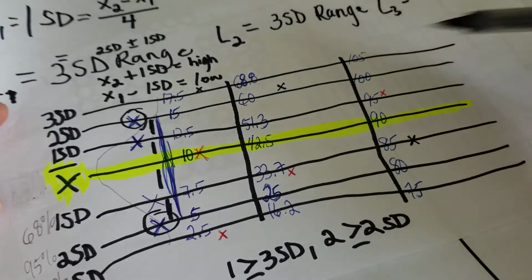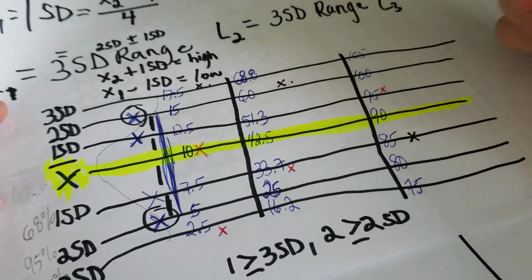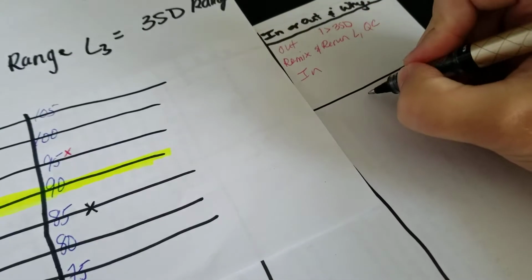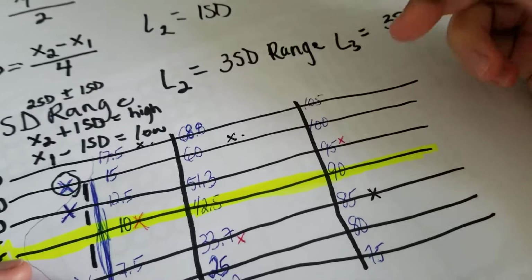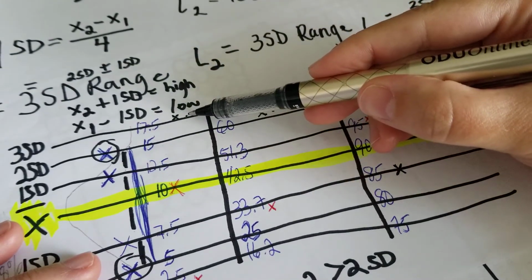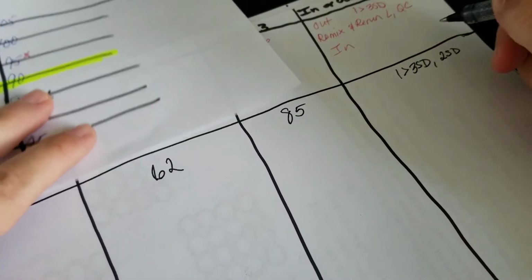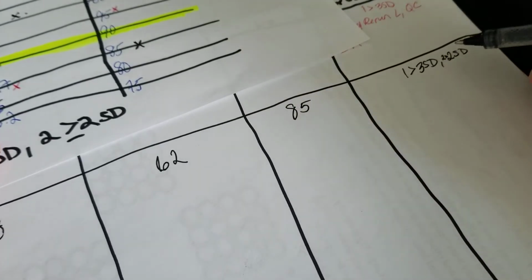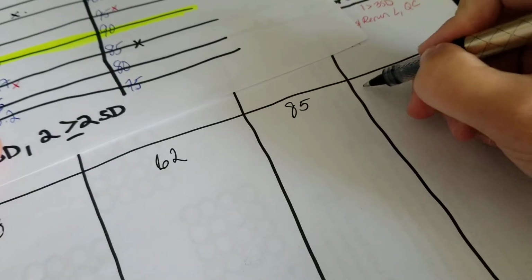All right, so seeing here, we have 1 greater than 3SD, 1 greater than 2SD, and 1 1SD. All right, so we have greater than 3SD, and even though we see that 1 is greater than 2SD here, 3 is greater than 2, right? So that makes it so we have 2 greater than 2SD. So we're breaking all the rules here. Oops, I forgot that part. That's so tiny, I'm sorry. So this is 2 greater than 2SD. So that is absolutely out.